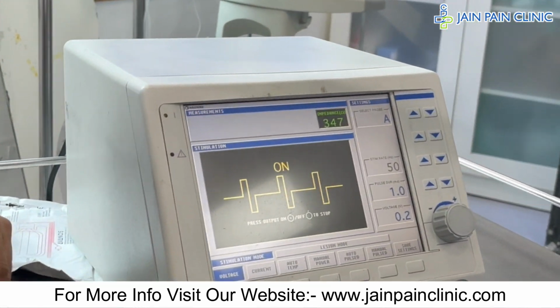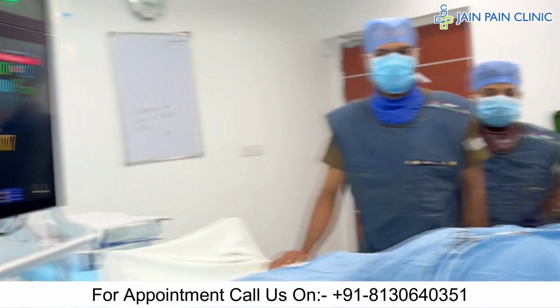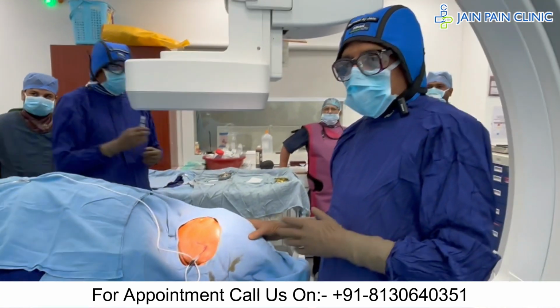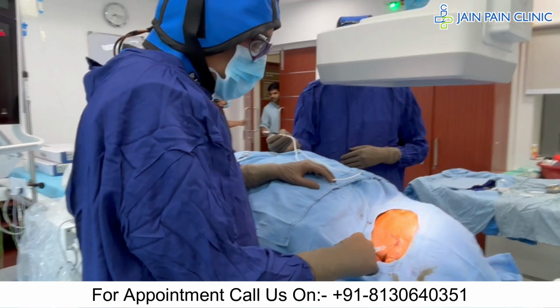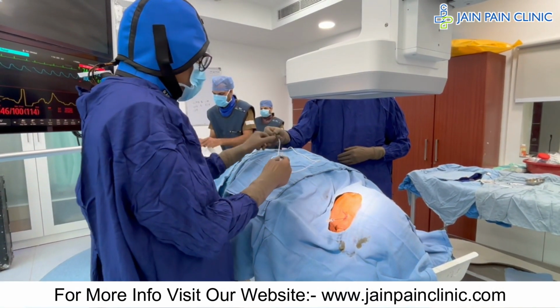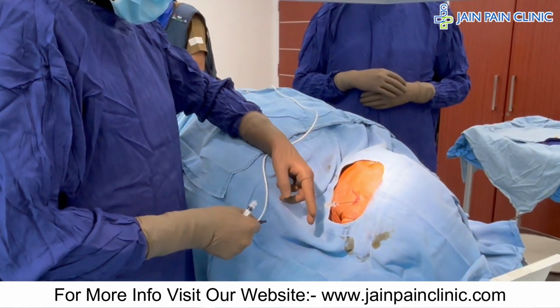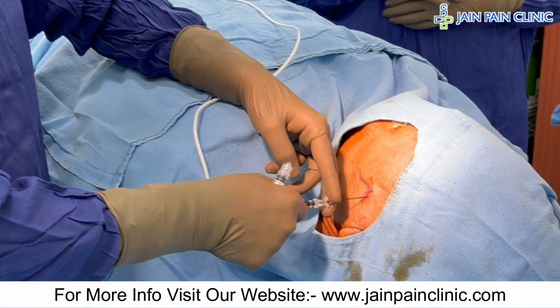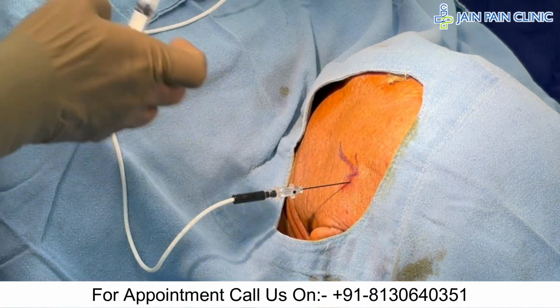Now we will inject the local and do the conventional RFA for lesion. So we have given the local, 1.5 ml, and now we will wait for 1.5 minutes and do 4 conventional lesions at 80 degrees for 90 seconds in all the 4 quadrants.